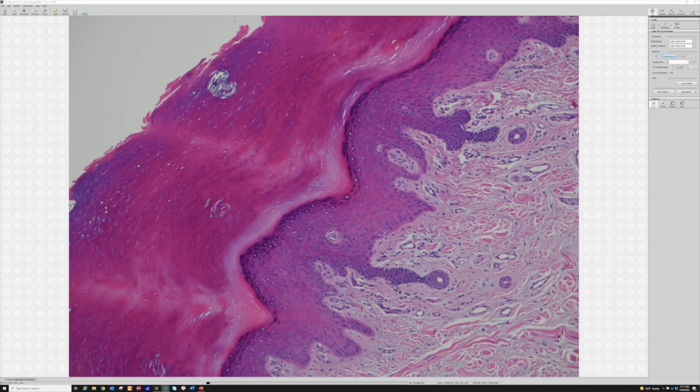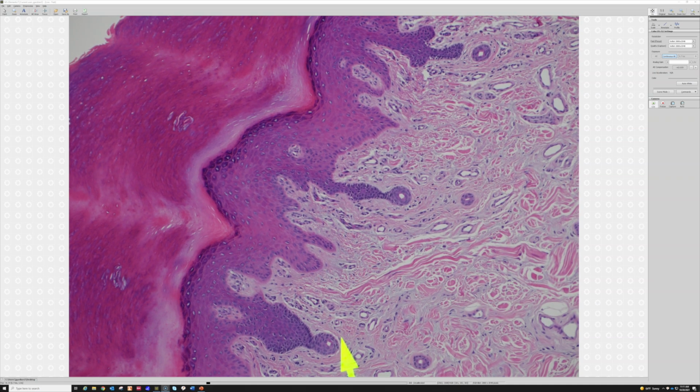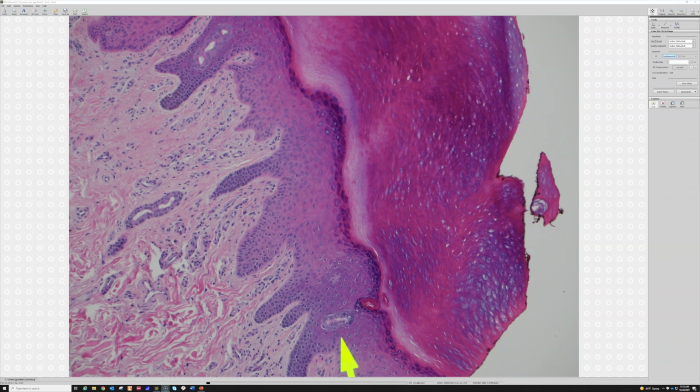So they're everywhere. And then here's more angles. See, this part of the tissue is folded a little bit, so instead of cutting straight up, we're seeing the ducts kind of look like they're coming straight out at us instead of going longitudinally up towards the surface. All right, so that is eccrine coil, eccrine duct, and acrosyringium.